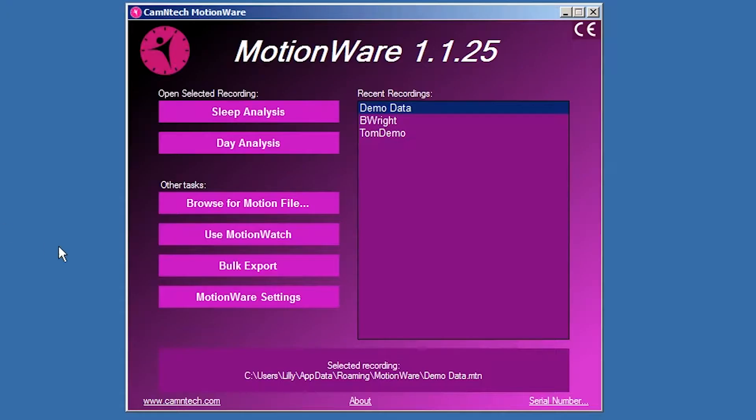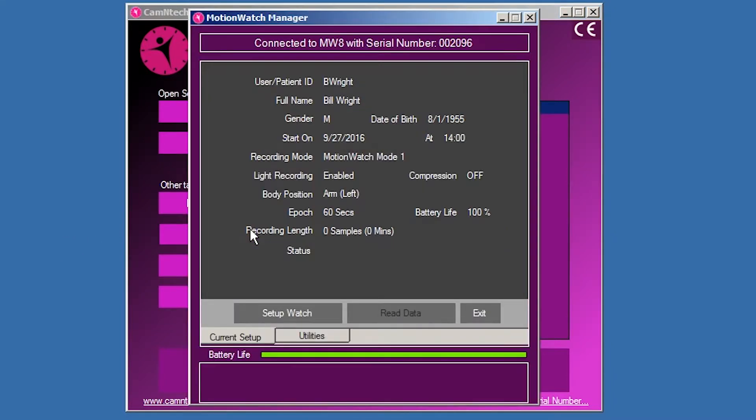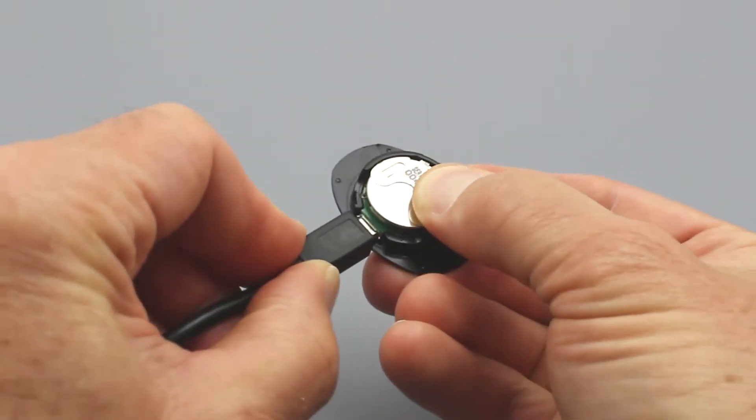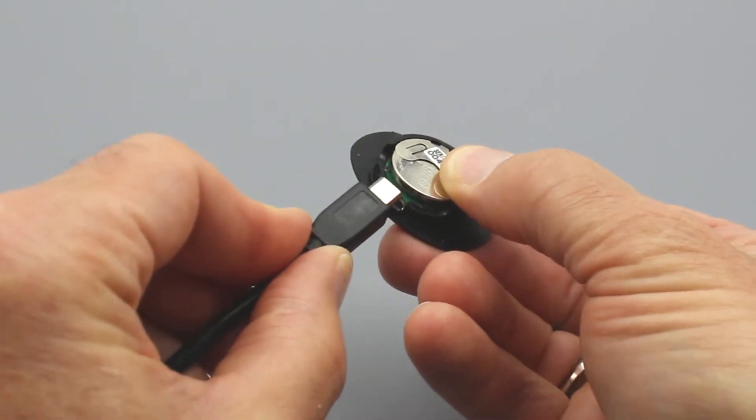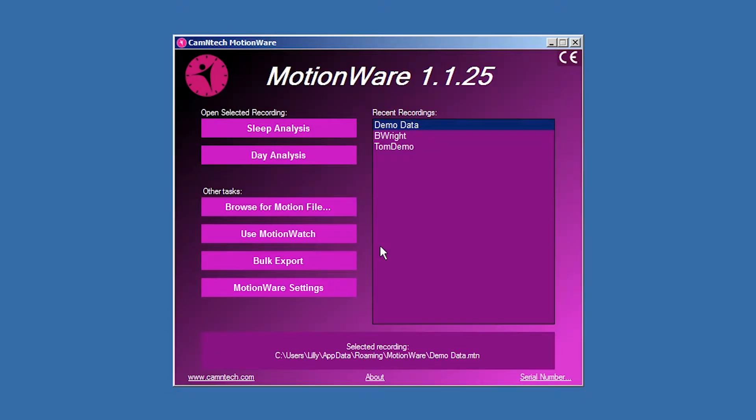If a Motionwatch is connected but this screen is not shown, click on the Use Motionwatch button on the front screen. The Motionwatch Manager screen is automatically closed when the Motionwatch is disconnected.